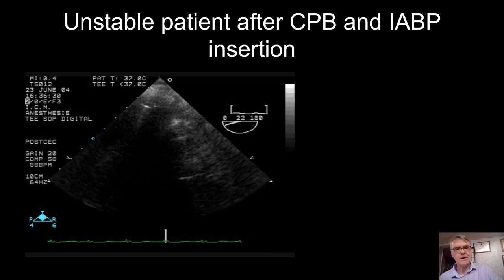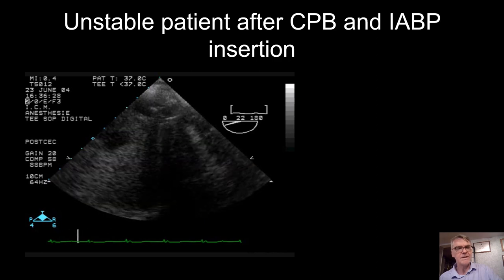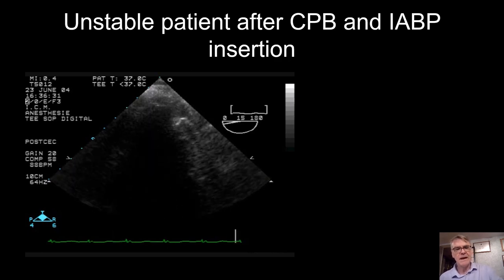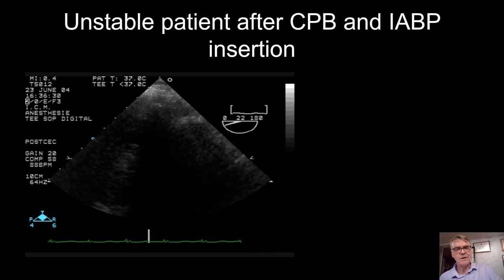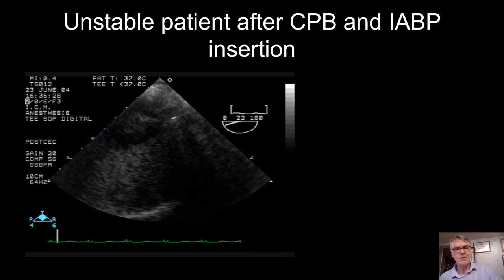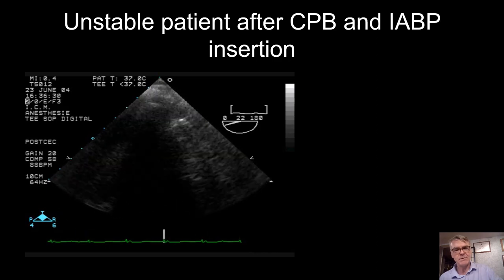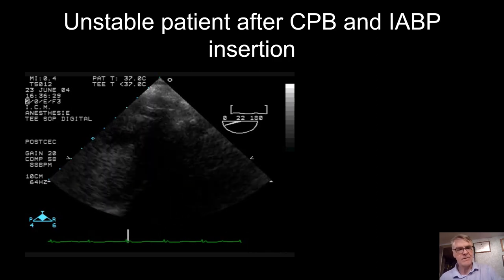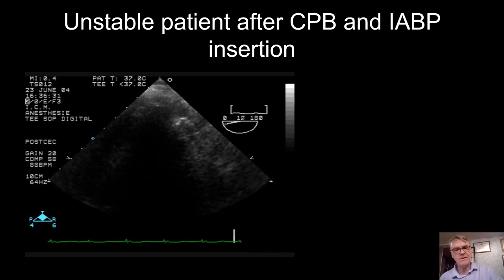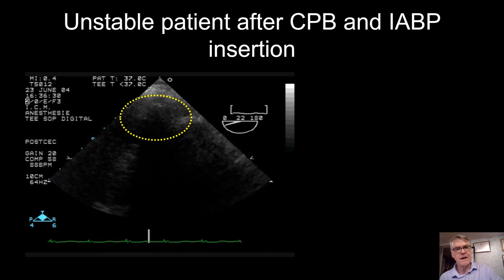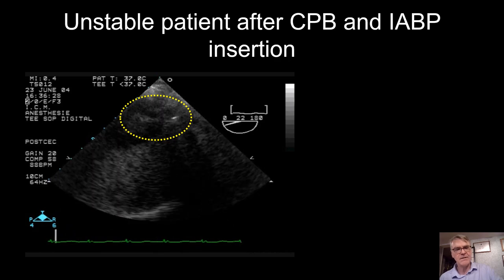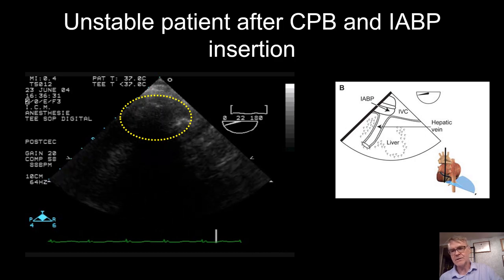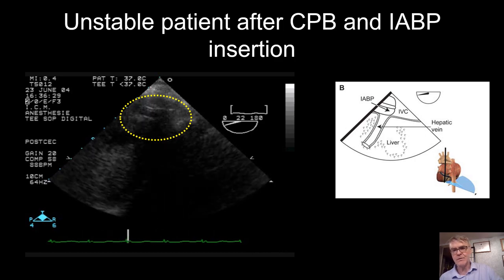Another example: a very unstable patient from 2004, difficult to wean from bypass. An intra-aortic balloon pump was inserted. At that time, people were not using ultrasound much for vascular access. On the TEE view, you can see something inflating and deflating in the inferior vena cava — and that was in fact the intra-aortic balloon pump, misplaced in the inferior vena cava instead of the aorta.